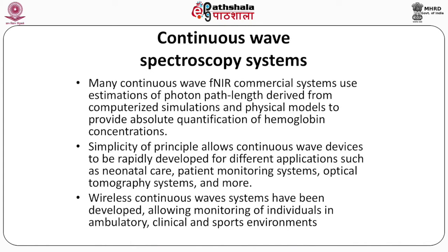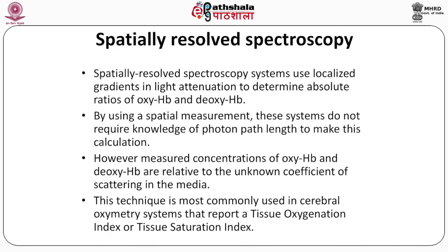These continuous wave systems are often wireless. So wireless continuous wave systems have been developed in recent times, which allows monitoring of individuals in ambulatory, clinical and sports environments also.